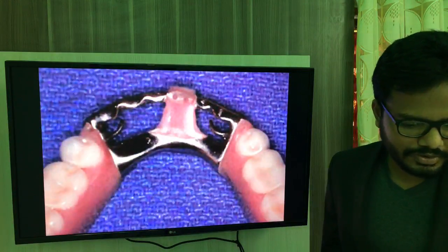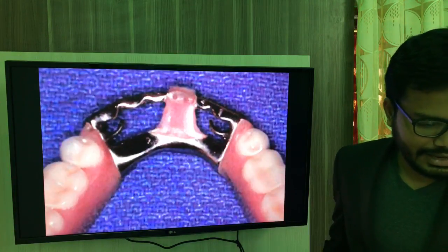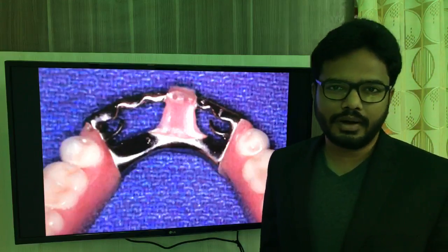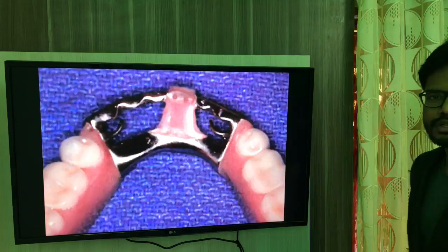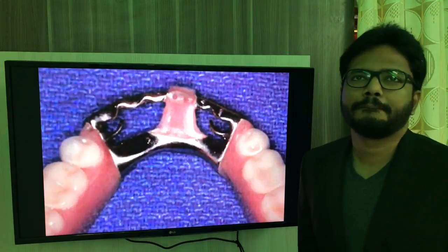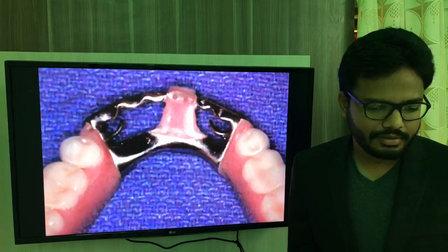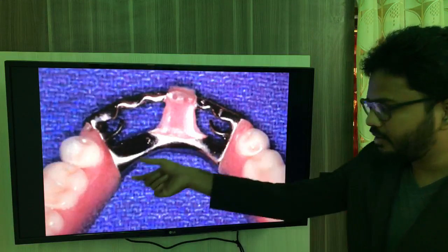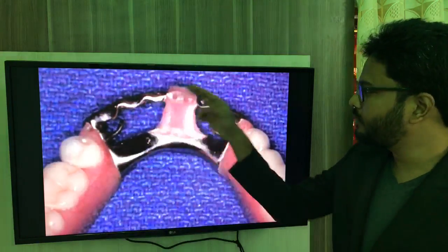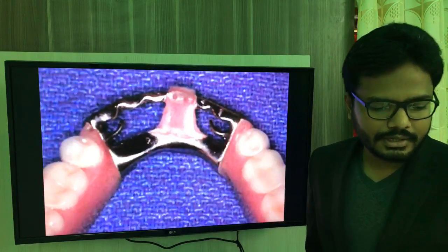Yeah. Now Abhishek. What's this? It's also called as continuous bar. So what does this mandibular major connector, and what is this mandibular major connector? So, I mean, lingual bar is something only when you have a single extension, right? But you have two extensions, a continuous bar. It's also called as, yeah.